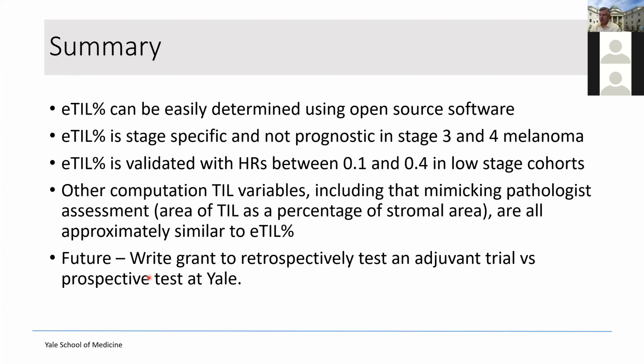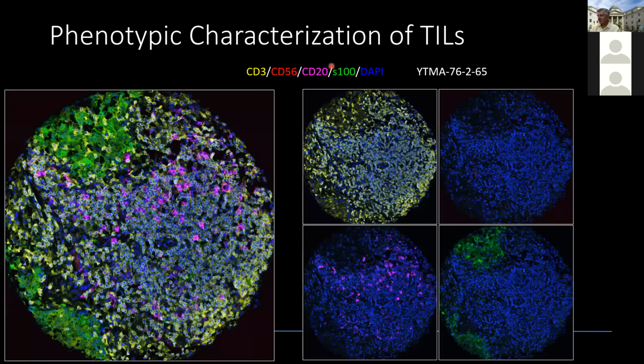But this raises the question, well, what are those TILs? What are we actually looking at? In fact, one way to think about that would be to look at the actual TILs with a molecular tool. And so Fazin Ang, a new postdoc in my lab, has taken our molecular quantitative fluorescence images like this, and then we take different TIL variables.